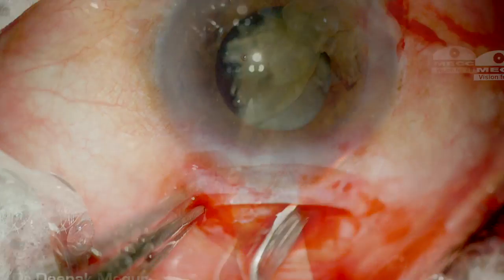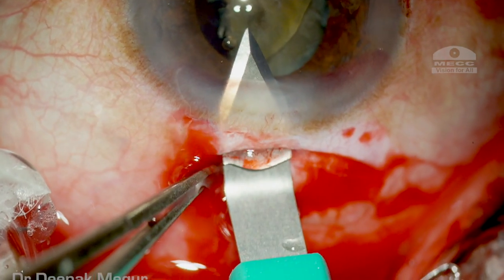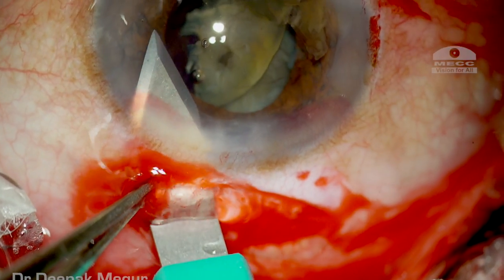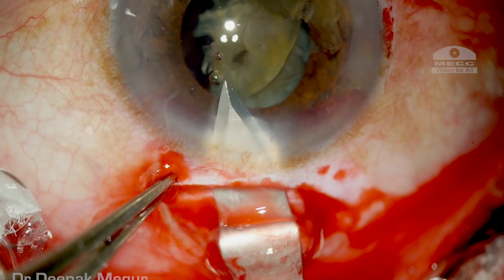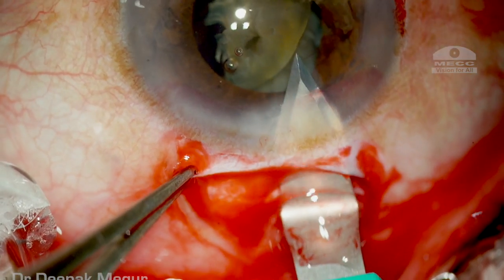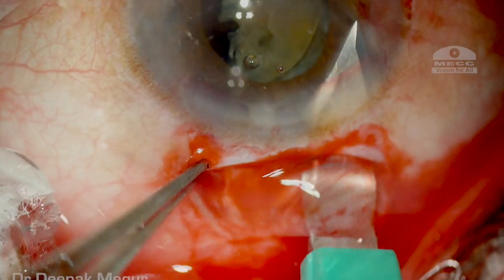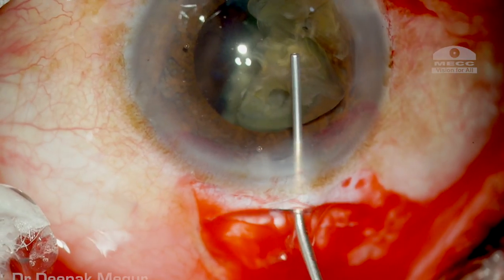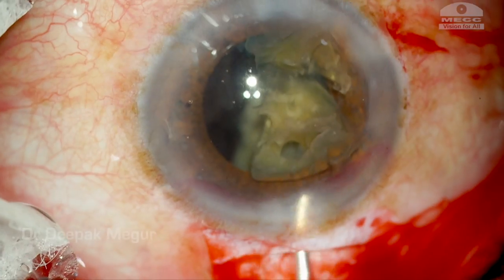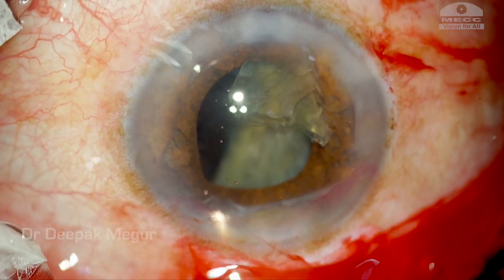The plane of the tunnel is below the plane of the original sideport incision. Once a sclerocorneal tunnel of about 6 to 6.5 millimeters is created, I use a 2.8 millimeter keratome to enter the eye, then extend on either side with the inner lip of the tunnel being parallel to the limbus. Under the cover of viscoelastic, the two smaller nuclear fragments are expressed out.